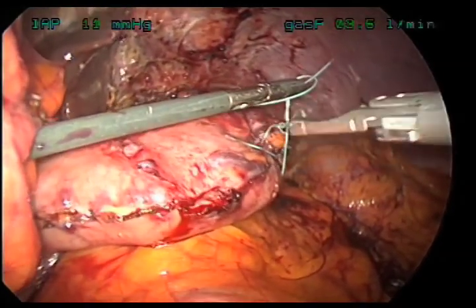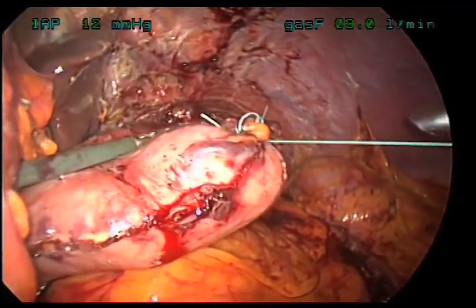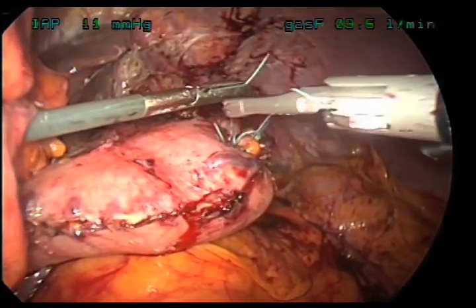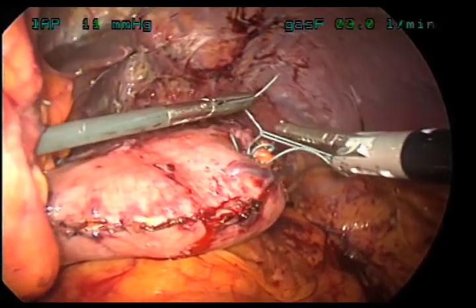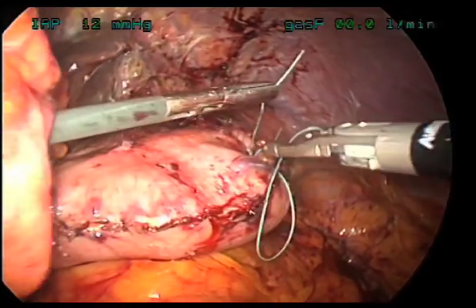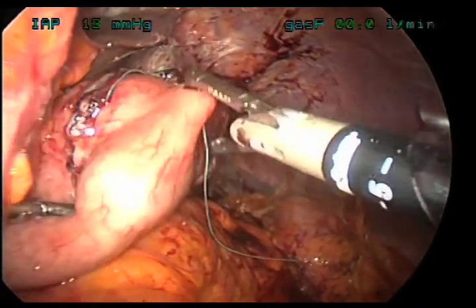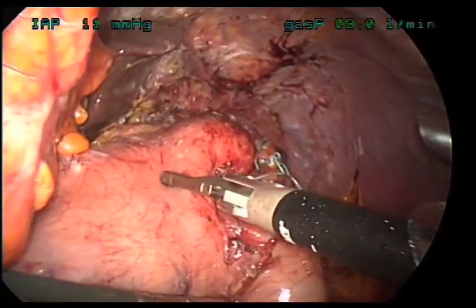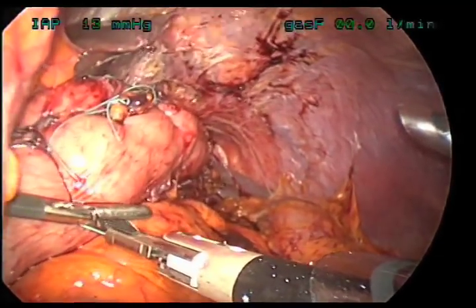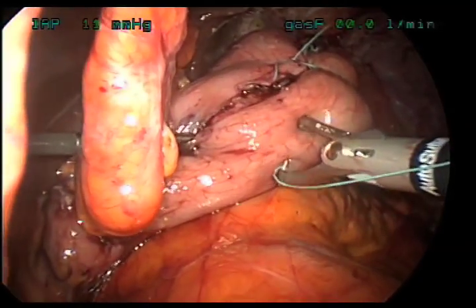There's the endo stitch passing the needle back and forth and tying our knot. This is the first knot. We're going to take several sutures down the stomach on the greater curve in order to push it in on itself. The greater curve is the part of the stomach which expands when you eat a good meal, so I'm taking away the stomach's ability to expand when the patient eats a big meal so they get full very easily. Now we're taking another bite — this is an interrupted bite, meaning they don't run together — and I am folding the outer portion of the stomach in on itself. You can see the stomach fold in on itself.